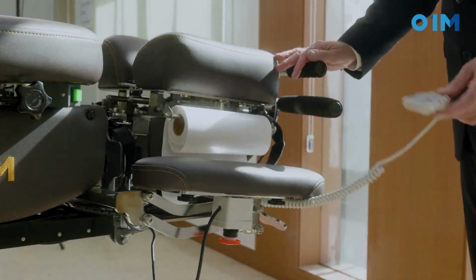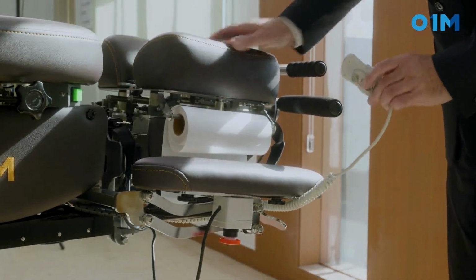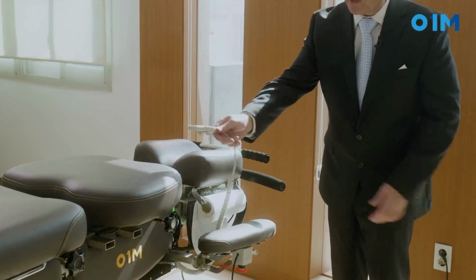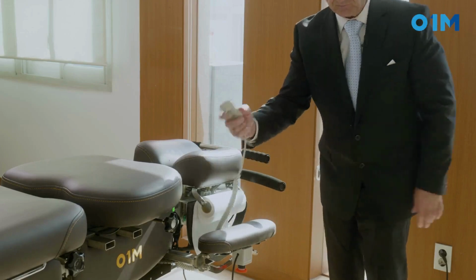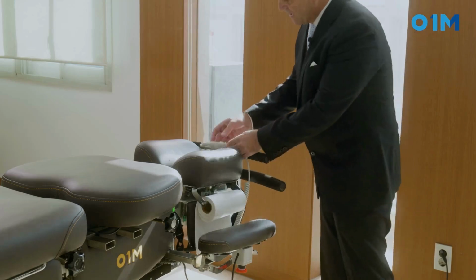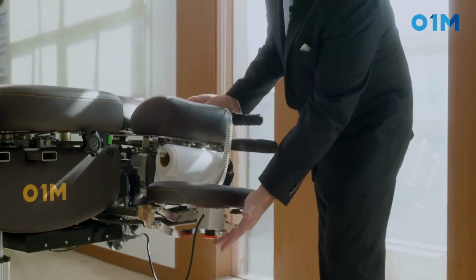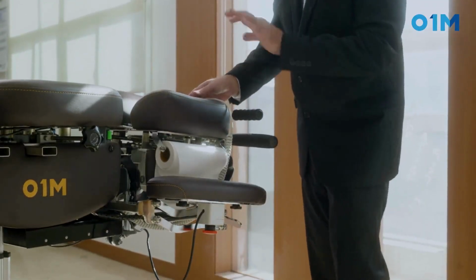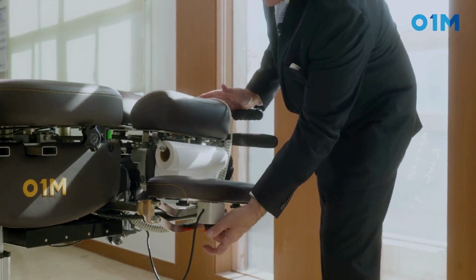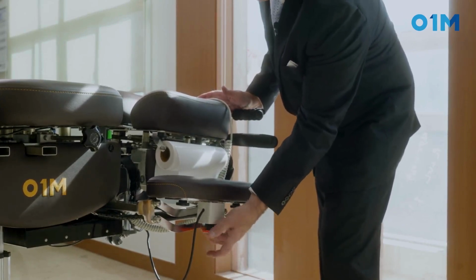You have two safety buttons here on that table. One is used when the patient is supine, facing up, and he can hold it in his hands. Otherwise, we let it stay right here. And this one is when the patient is prone, facing down. You press it to stop everything, press down, and to release, twist it. Press down, twist it. Press down, twist it.